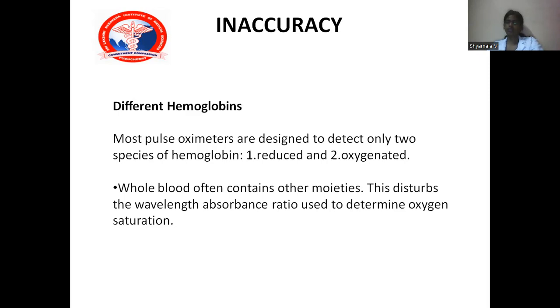It can also be used for monitoring in the post anesthetic care unit, for monitoring during transport, and for monitoring oxygen saturation in patients who are taking drugs that cause a decrease in breathing and low oxygen saturation, like patients on opioids. It can also be used for avoiding hyperoxemia, and for monitoring peripheral circulation and systolic blood pressure. The main advantage is it is non-invasive, continuous, simple monitoring, and it gives accurate reading.